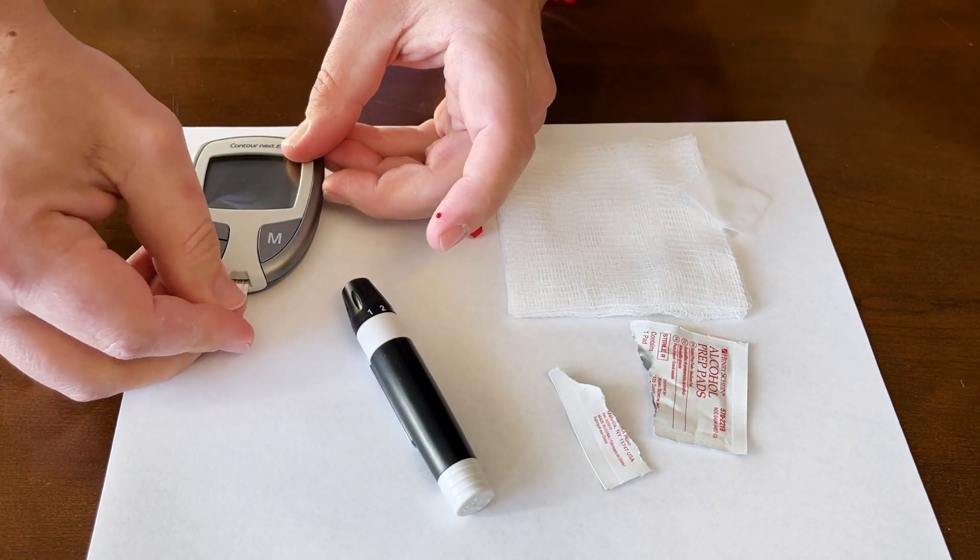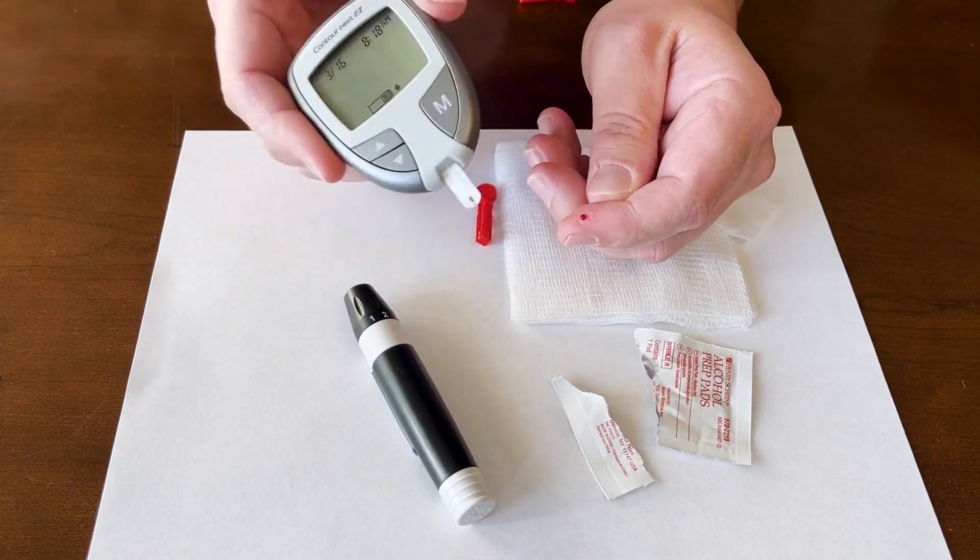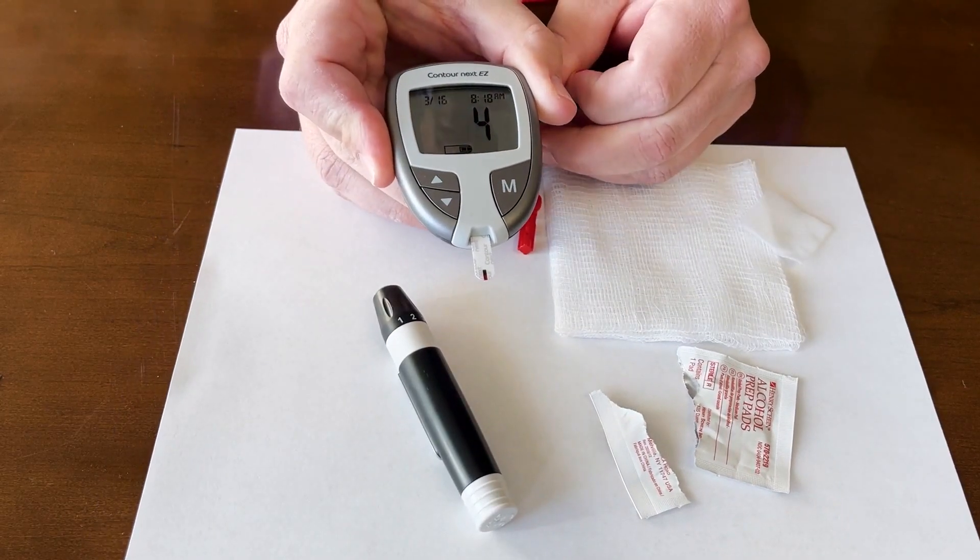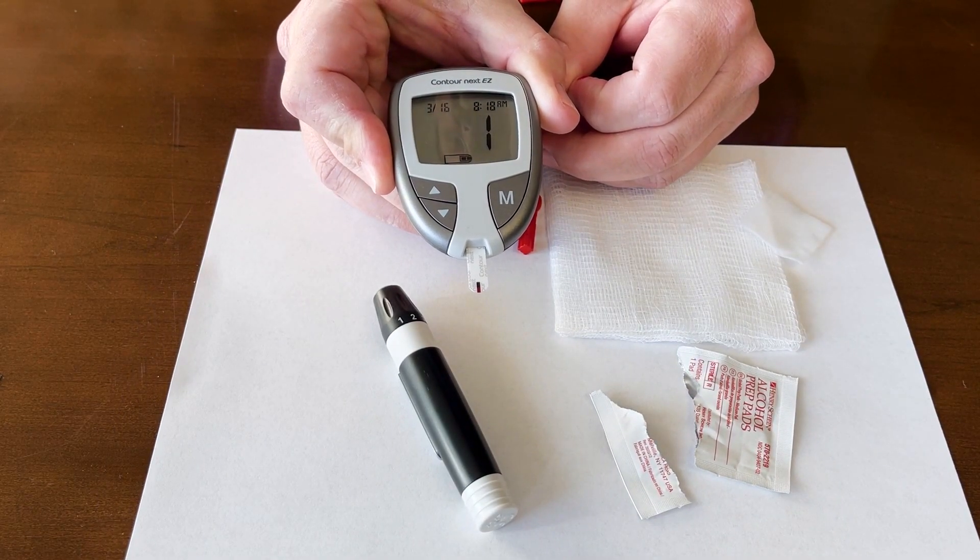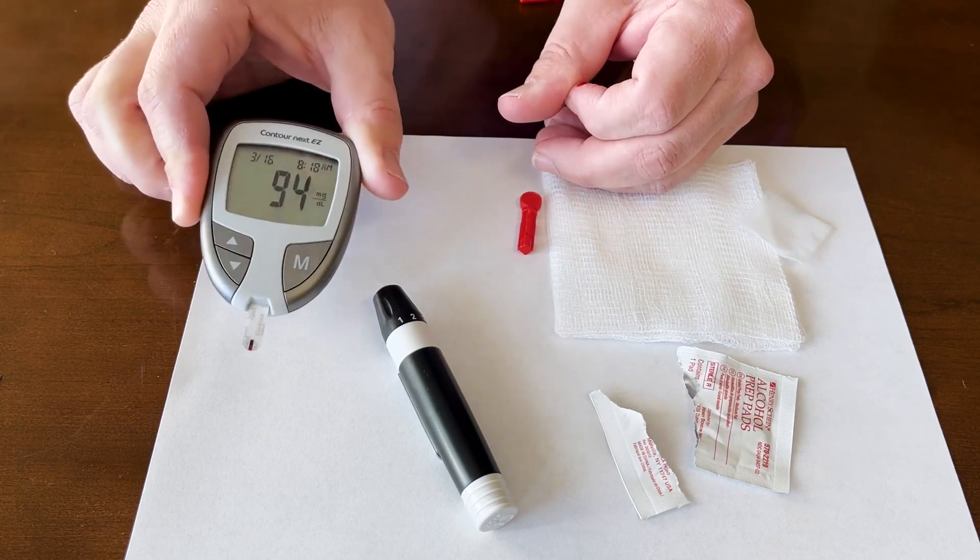I'm going to put it in my meter. Just like that. You'll see the meter will self-turn on. Take that blood. You'll see that the blood will go right into the strip. And there's my blood sugar.